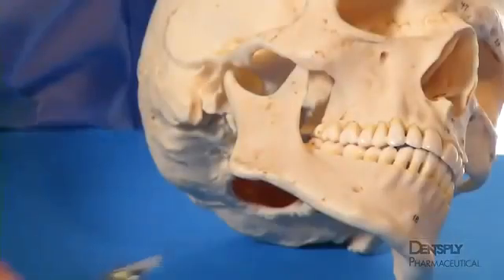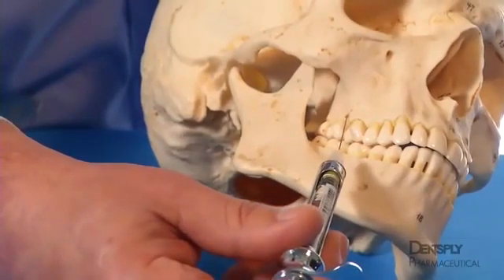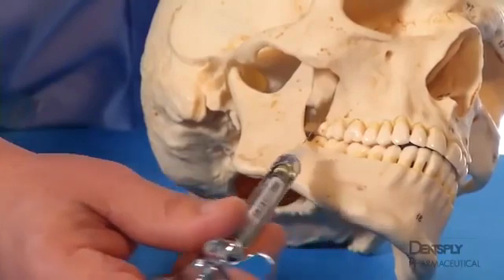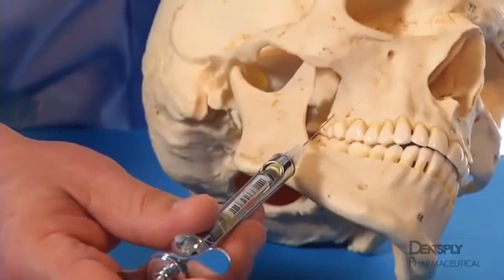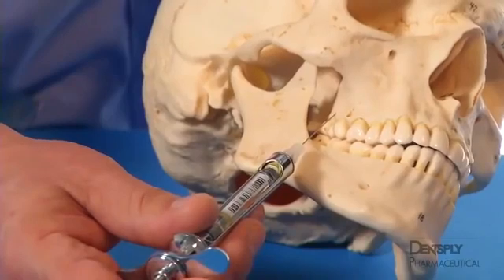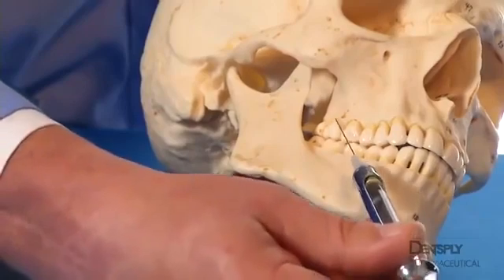If the insertion point is too anterior or too close to the alveolar process, or if the angulation is too vertical or too medial, premature contact with bone will occur. In these situations, the needle should be withdrawn and correctly repositioned for a new insertion.